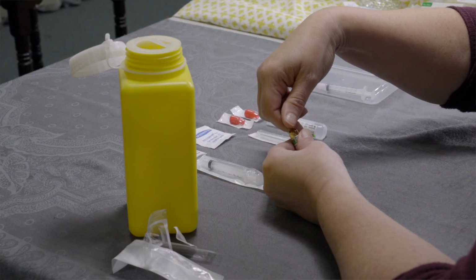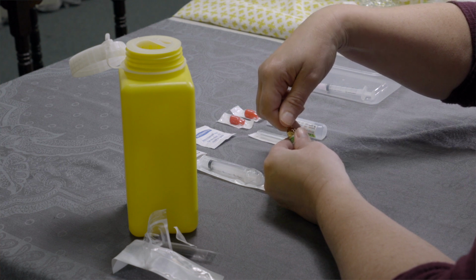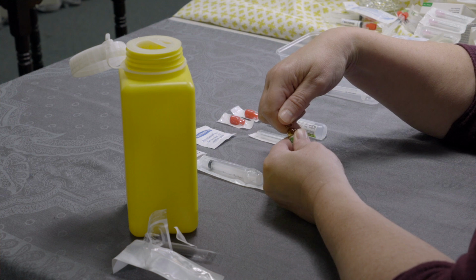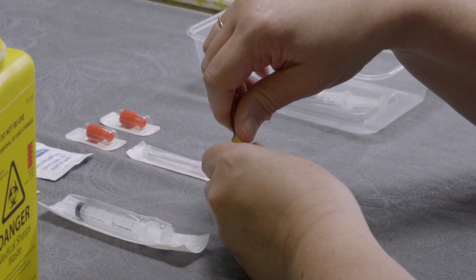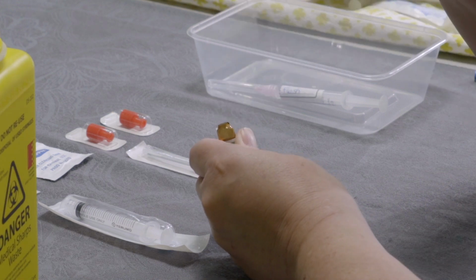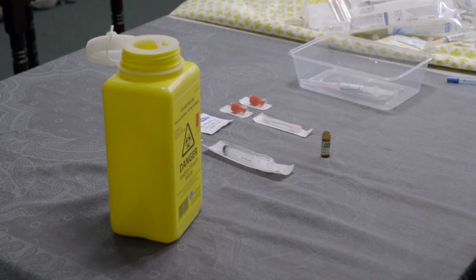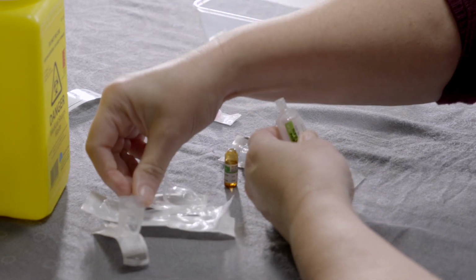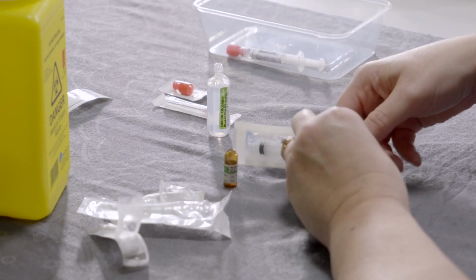With the hand you're most comfortable with, grip the top between your thumb and index finger so that the thumb covers the dot. Now simply snap the top off the ampule away from yourself. Some ampules are harder to break than others, so this may take a few goes. Glass ampules have a little bit extra in them, so if you spill a small amount when opening it, it shouldn't matter. If you are using a plastic ampule, open by simply twisting the top until it breaks off.